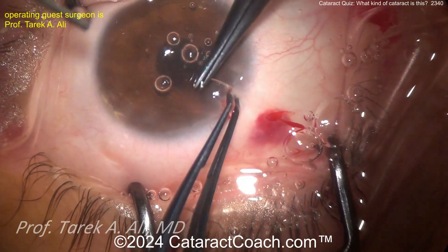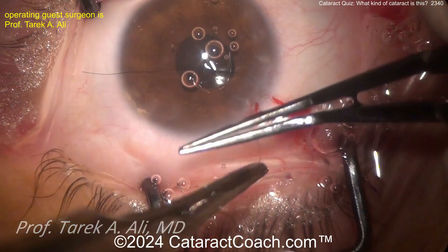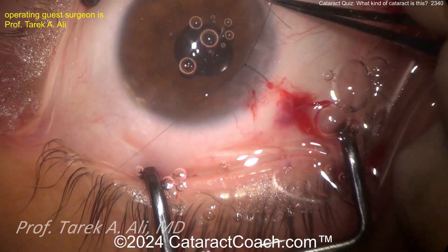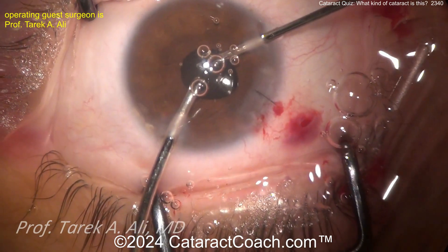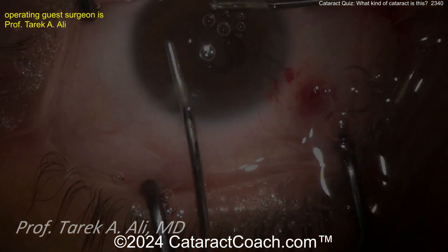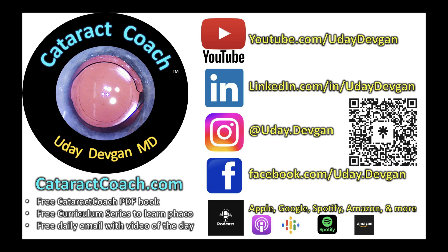I hope you passed this cataract quiz. If you go back and look at the initial picture, you'll notice in the title picture you can actually see the capsular rhexis edge. The surgeon is putting in a suture — I think that's a great idea for this incision, because it's a little beaten up from extracting the IOL, plus you had to enlarge it. A suture — no big deal, easy to put in at the time of surgery. Remove the viscoelastic with a bimanual approach — very nicely done. For more cataract quizzes, go to cataractcoach.com and look for the category 'quiz.'